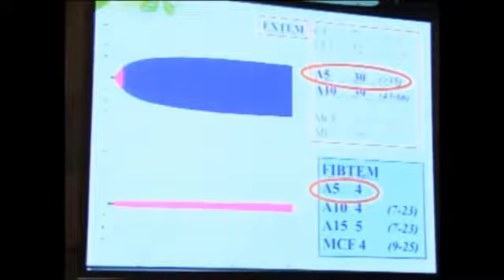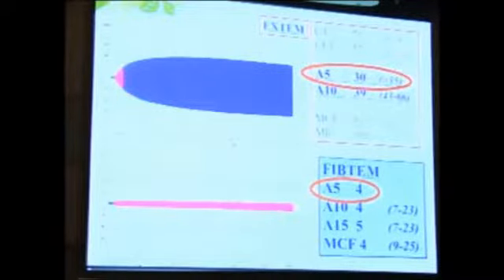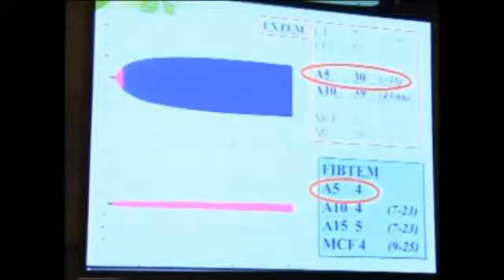No. So I told you that TEG ROTEM only measures two things, excessive fibrinolysis and clot strength. So what's the problem here? What's the problem? Clot strength. This is a weak clot, and this patient is bleeding nonstop. And then this patient also tells us one more thing, he's Jehovah's Witness. He doesn't take blood. So besides operating and stopping the bleeding on this patient, what else should I do?